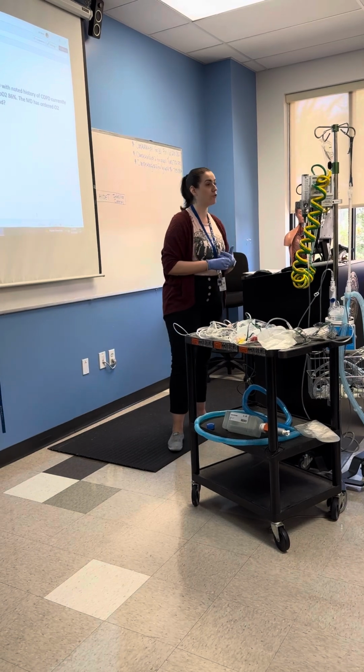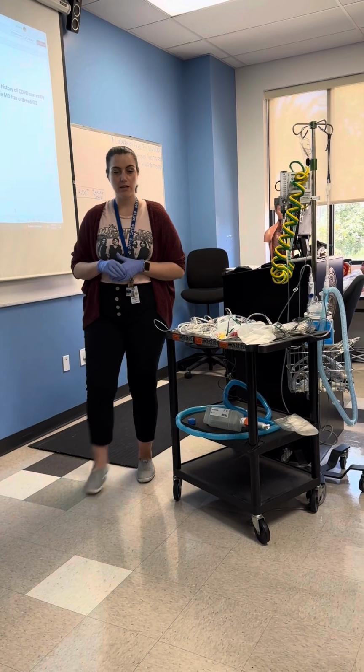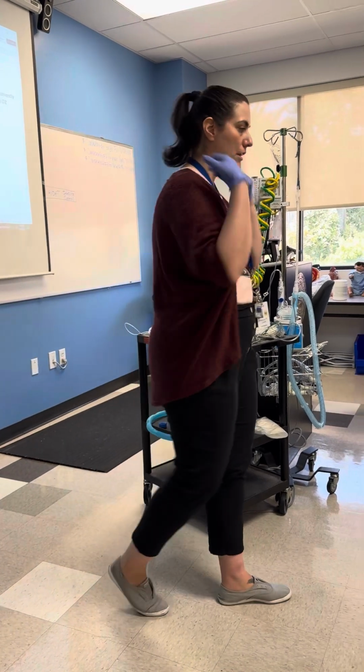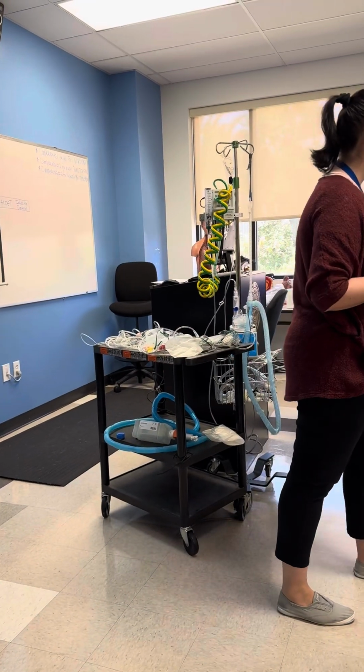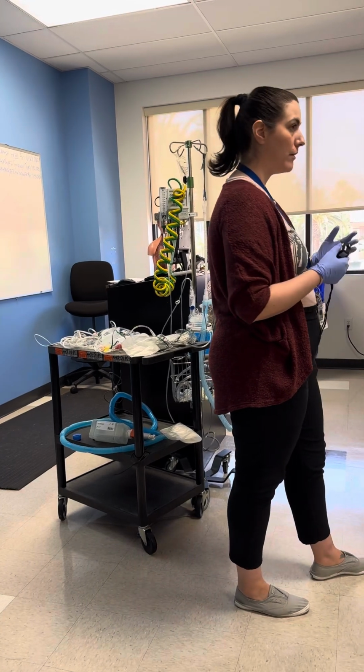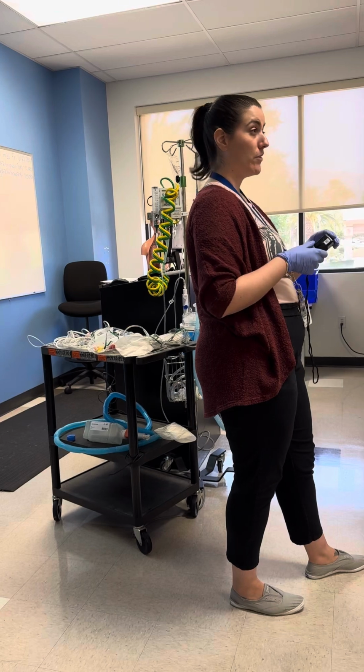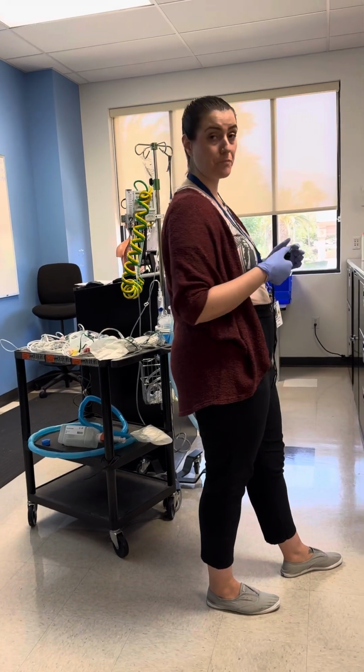Where now I'm gonna watch you, how do you do those vitals? So at this point, it's going to be necessary that you have your pulse oximeter with you and your stethoscope around your neck for competency number 2. So how to check the vitals? We remember this from week 1, or do we need a little review on how to do this? A little review, maybe? Or remember? Sure, go for it. Why not?